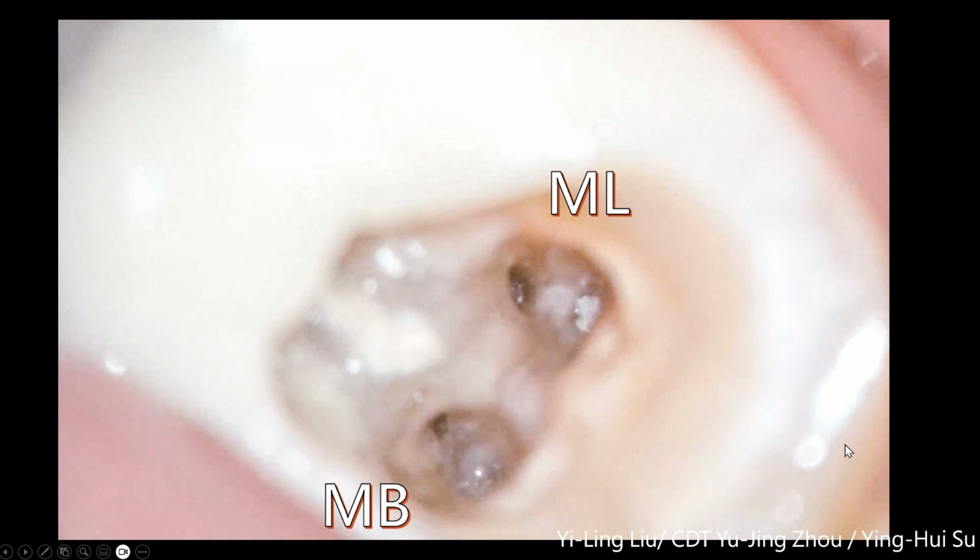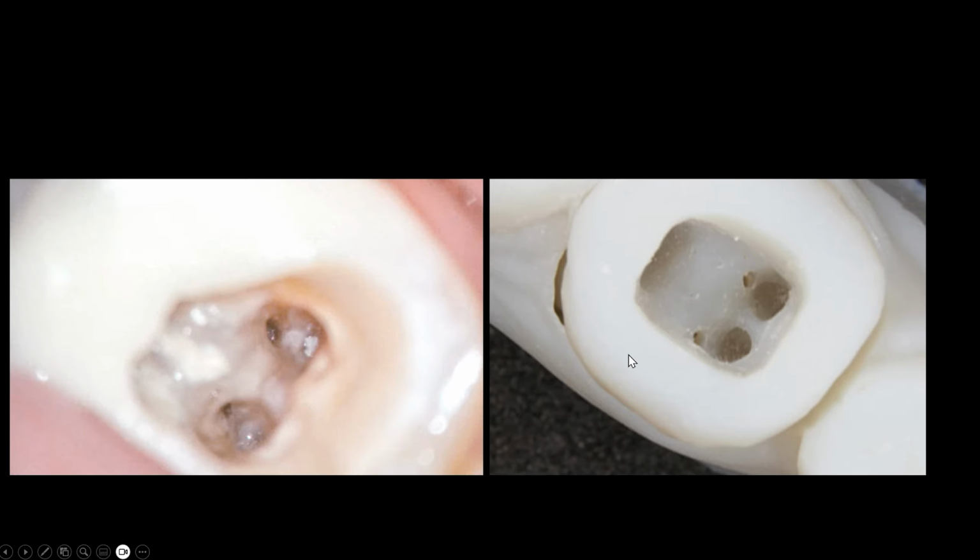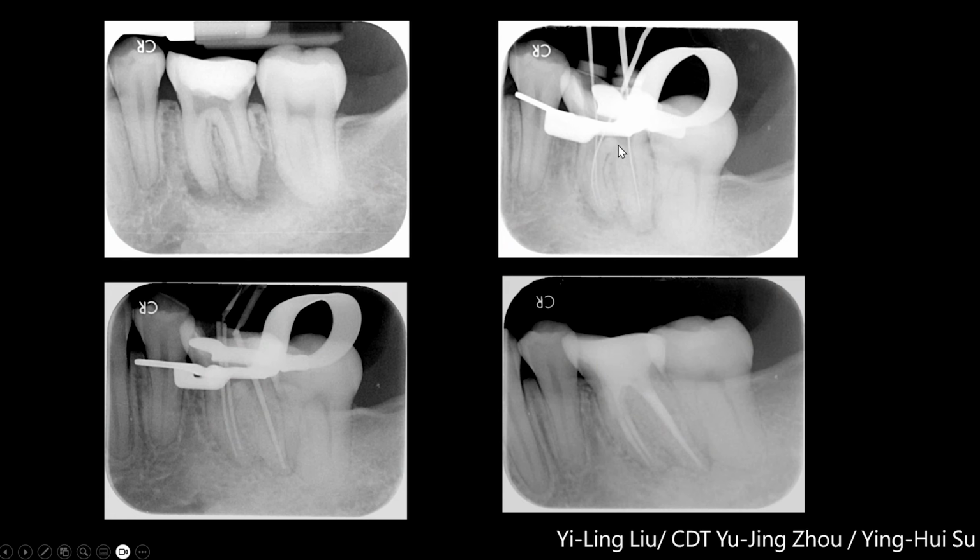And this is after I drill using the guide. As you can see, the more black one is the true path that I drilled through, and the white one is the wrong path. Okay, so I put this together like this, and this is our virtual tool, where this tool is the wrong path, and these two small ones are the actual mid paths. Okay, so we finished the root canal treatment. After we find all the canals, we use a rubber dam. We always use a rubber dam.